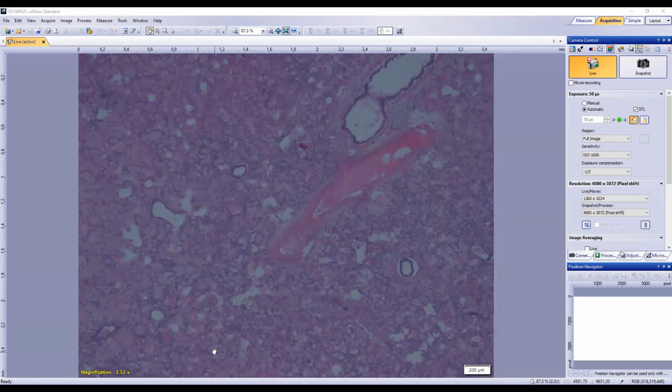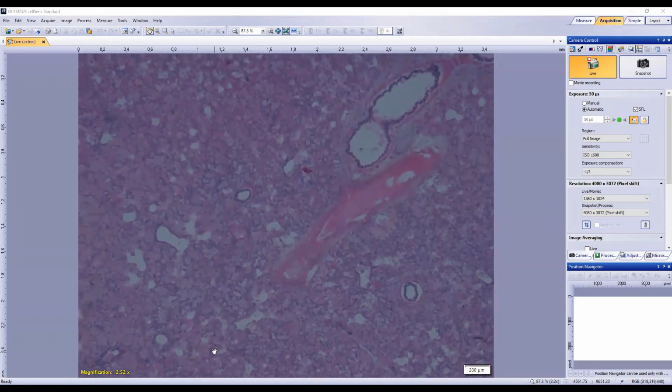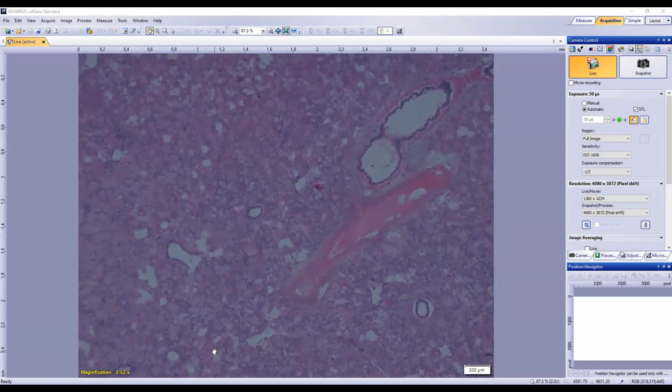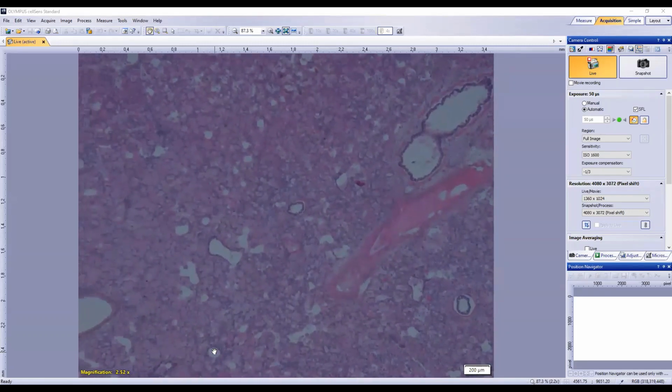But if we've got a severe diffuse process, then type 2 pneumocyte hyperplasia is a good histologic indicator of where we are along the time spectrum, but might actually further impair the animal's respiratory function in the short term. Yeah, smooth muscle hypertrophy. Okay. So what does that imply?